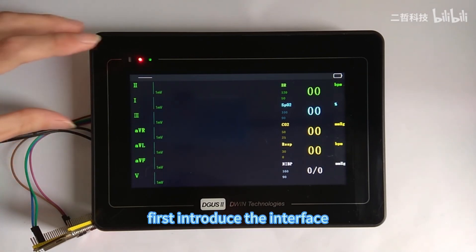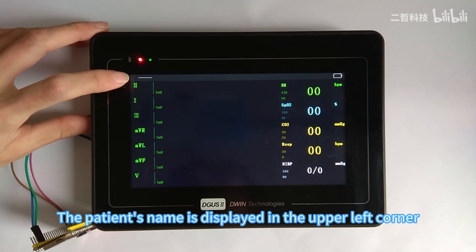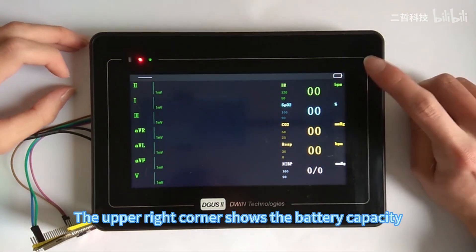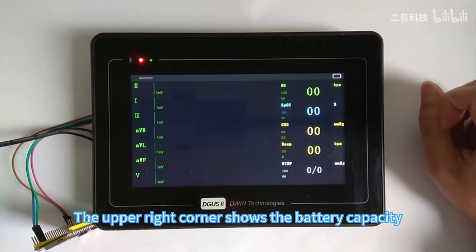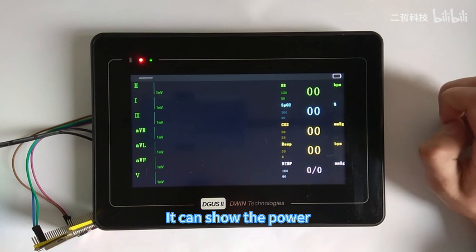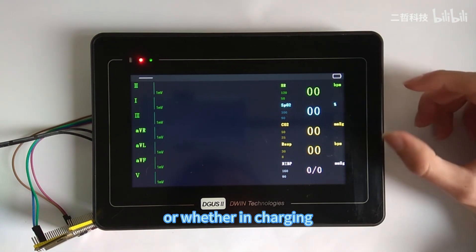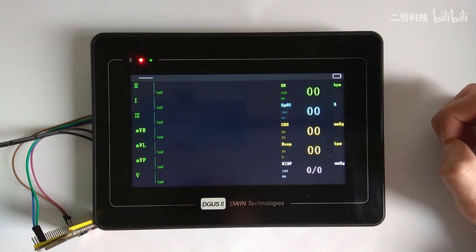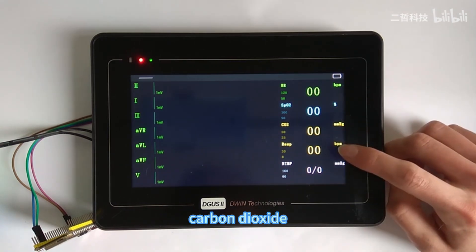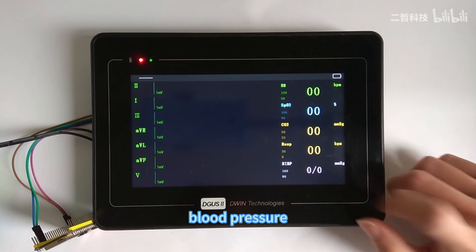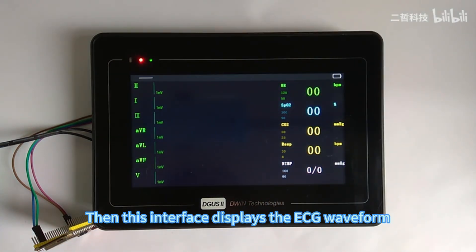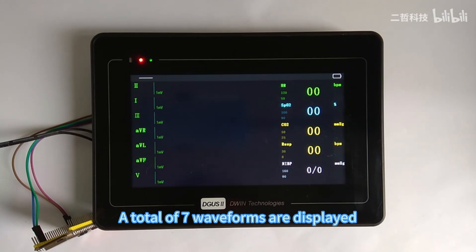First, let me introduce the UI interface. The patient's name is displayed in the upper left corner. The upper right corner shows the battery capacity. Because this is a portable ECG monitor, it can show the power level or whether it is charging. The remaining fields show heart rate, blood oxygen, carbon dioxide, respiratory rate, and blood pressure. This interface also displays the ECG waveform — a total of seven waveforms are displayed.